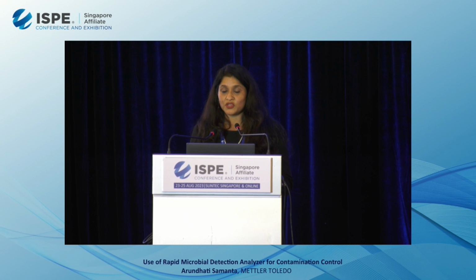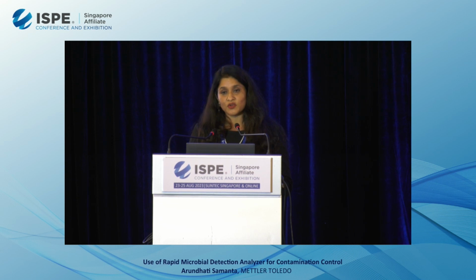For this specific experiment, this was a water loop at Stillmer's facility, so we were using the same water in the loop. So it wasn't really in a pharma circumstance, so this was definitely, I would say, an experimental loop that we were doing this analysis on, and for this loop, the signature was about 2,600.